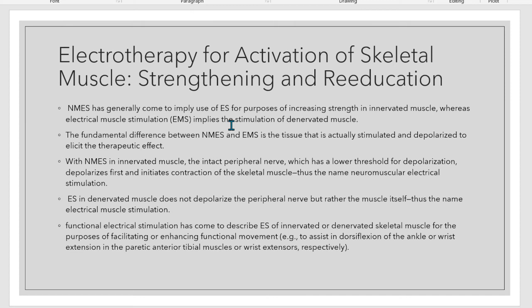Let's take for example na stroke ka, no? Dili ka makagunit sa baso. So butangan na siya og ES para makagunit ka. So, just like atong video nga gi-show nako, no? Stroke man to siya, so innervated to. But if you have PNI, pananglitan severe ang imong radial nerve, no?